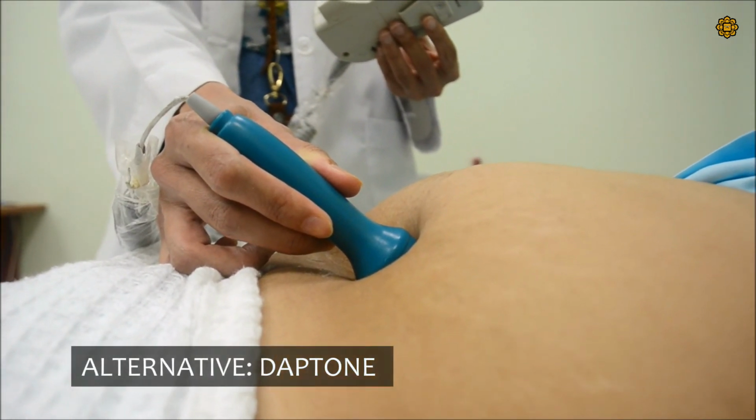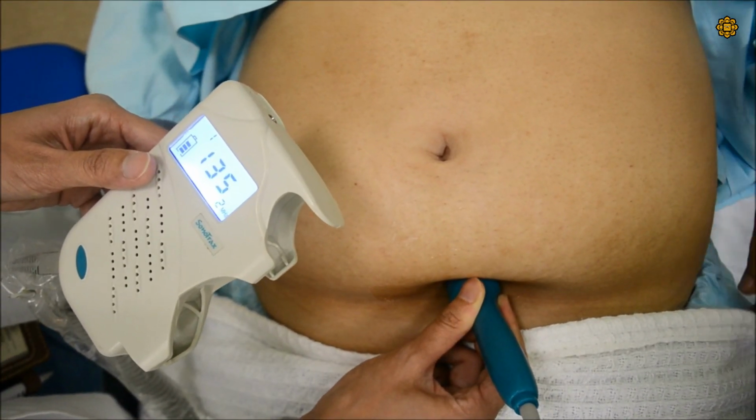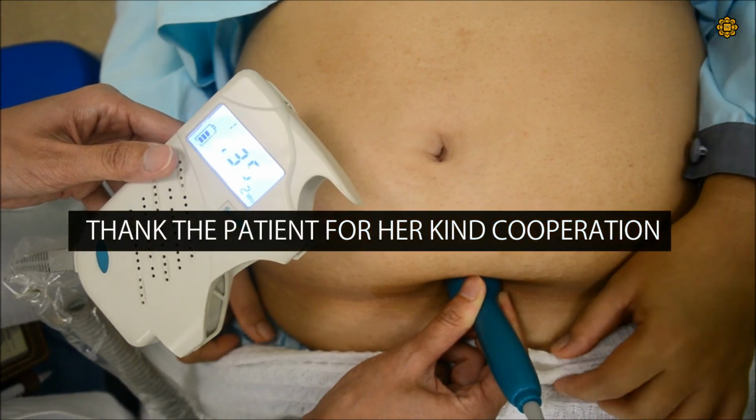Doptone can also be used to calculate the fetal heart rate. After finishing the examination, thank the patient for their kind cooperation.